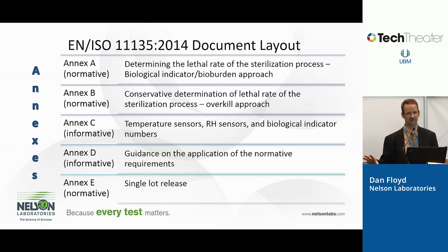There's a table in there that says if you have this much product volume that you're sterilizing, you have to use this many temperature probes, this many BIs. So most people still go off of that, even though it's informative.